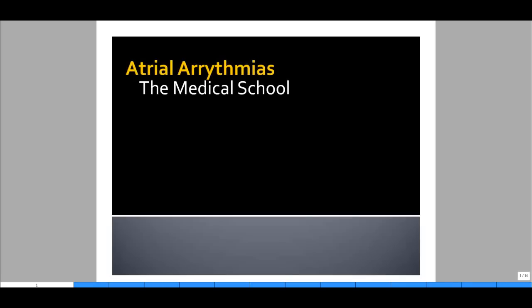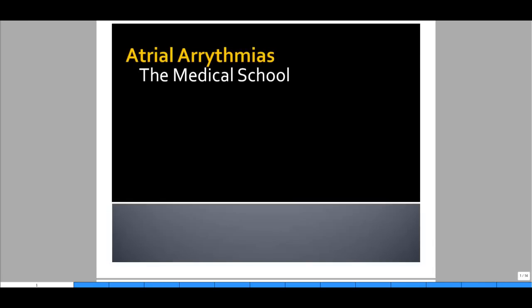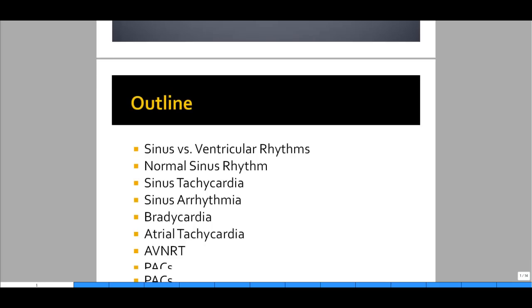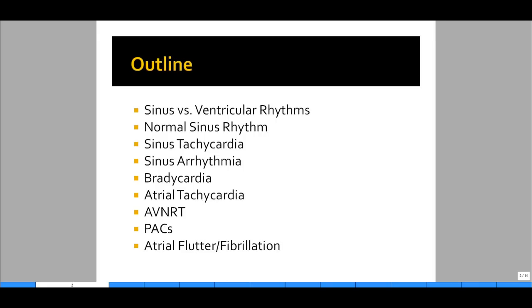Hey, this is Dr. K from the medical school. Today we're going to talk about atrial arrhythmias. The outline shows we're going to first talk about how to differentiate atrial versus ventricular rhythms, then talk about normal sinus rhythm, and then get into various topics about the different atrial arrhythmias that you may encounter on an EKG.